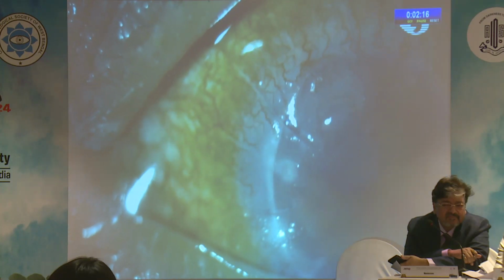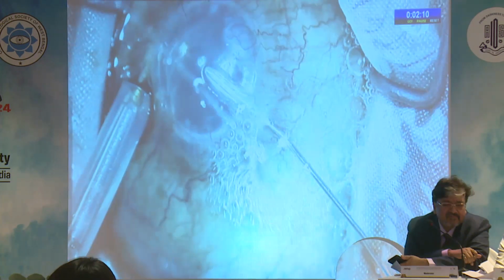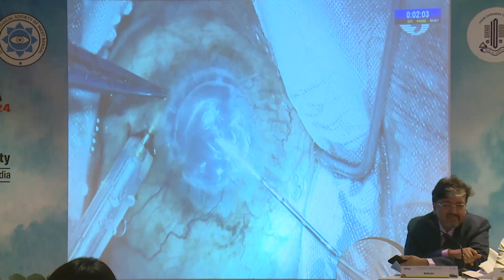This patient had a graft infection and subsequent failure in a full-thickness graft done for keratoconus with a poor ocular surface and atopy. In this case, we score the Descemet using the AC maintainer and trypan blue in the area of previously failed graft.